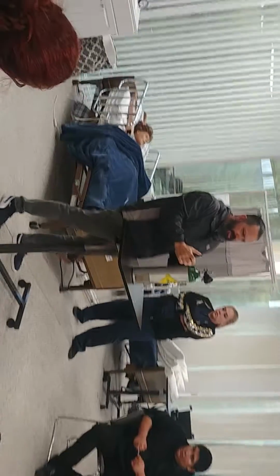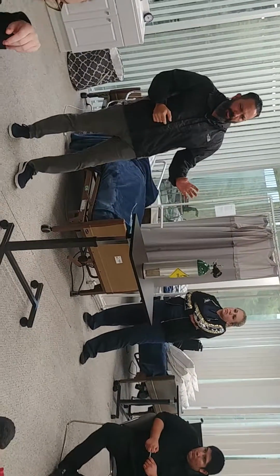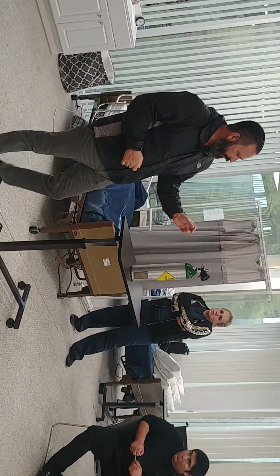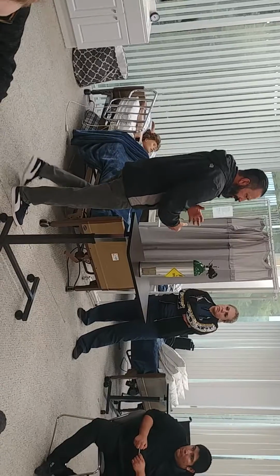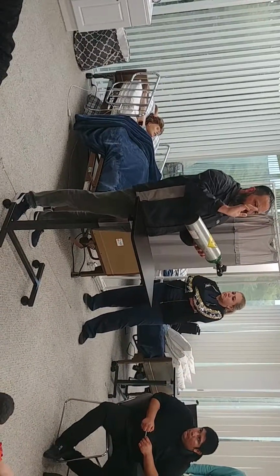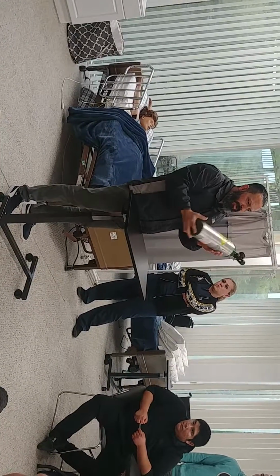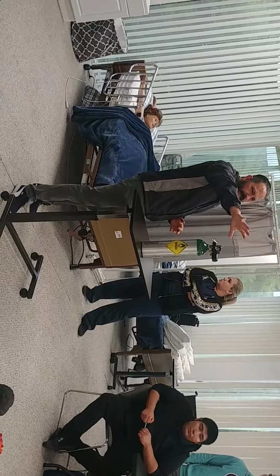This is a D cylinder. It just happens to be a D cylinder, and we reference this as a portable oxygen cylinder. Usually something this size gets carried in a bag with us, a jump kit, or at the head of the stretcher, where it may be mounted. It's portable. We can take it to wherever the patient is.